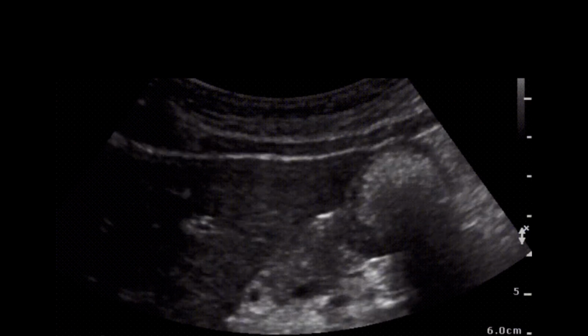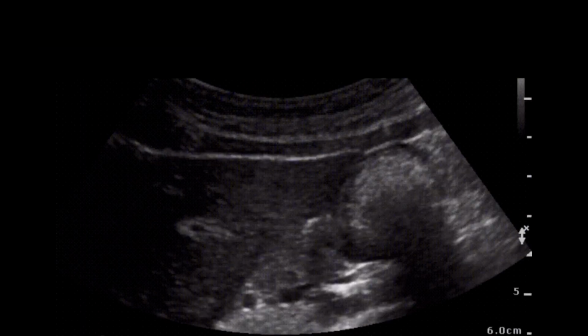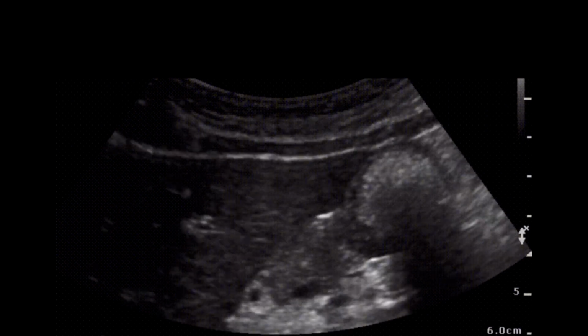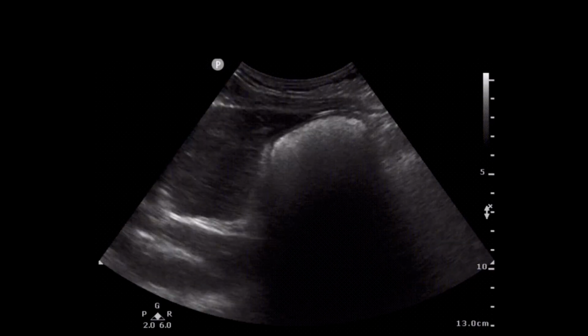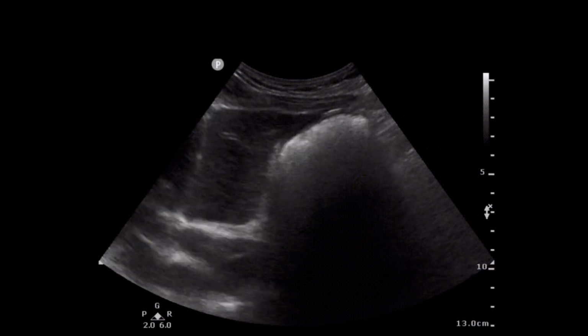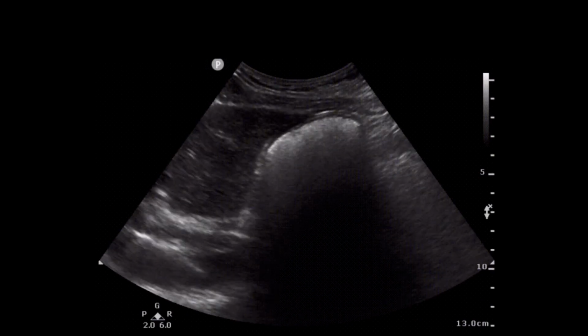Okay, moving on to solids. How do we describe solids? Frosted glass. Yeah, frosted glass. You'll see a heterogeneous or solid mass where the ultrasound beam doesn't really penetrate through. So you often see shadowing like you see here. You see how it shadows out? You can't really see beyond the solids that are inside the antrum.